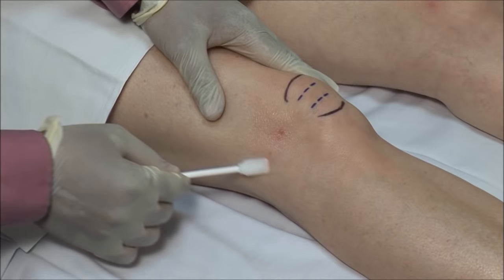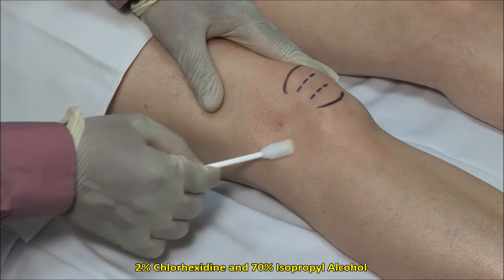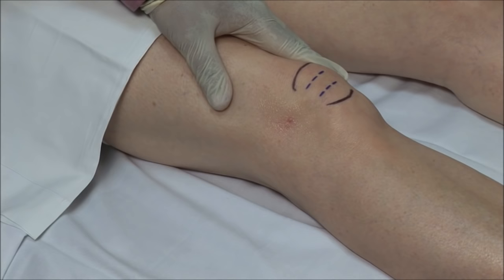Scrub the site of injection and then clean in an outward fashion. Here I am using a mixture of 2% chlorhexidine and 70% isopropyl alcohol. Alternatively, you can use povidone solution followed by alcohol.